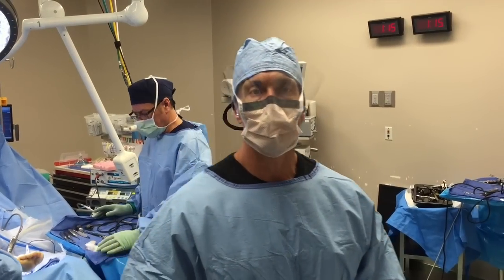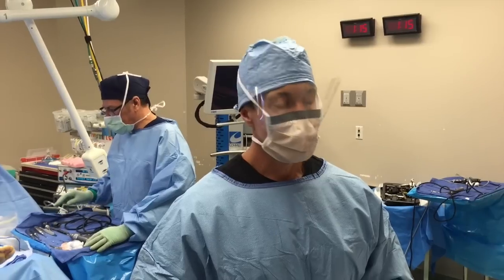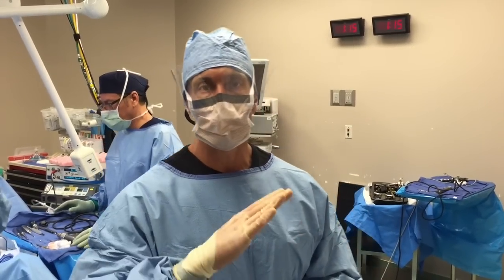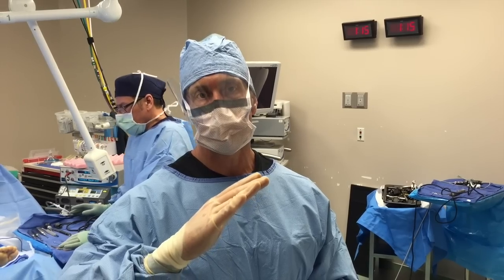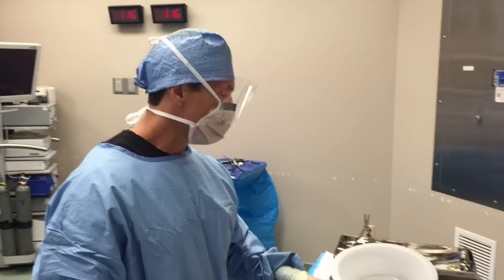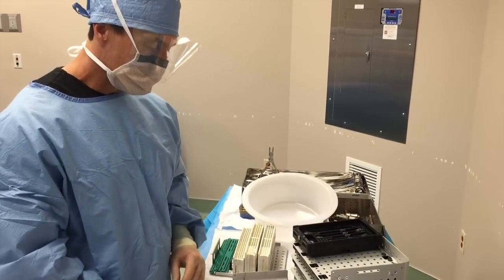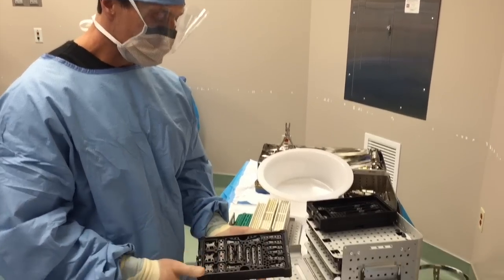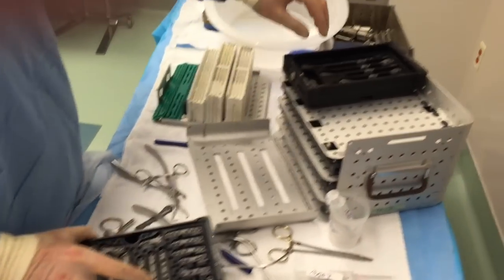Hi, this is Dr. Moore and today we're going to fixate a distal fibular fracture. The patient has an oblique fibular fracture just above the area of the tib-fib ligament and we're going to use the Stryker Variac system. The Stryker Variac system has multiple plates for different parts of the midfoot, but these are the plates we're going to use.